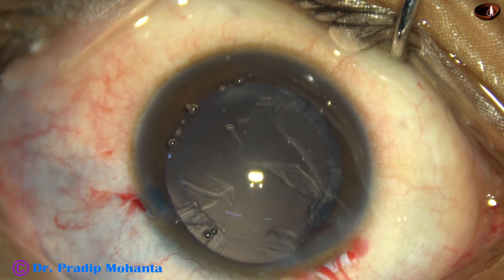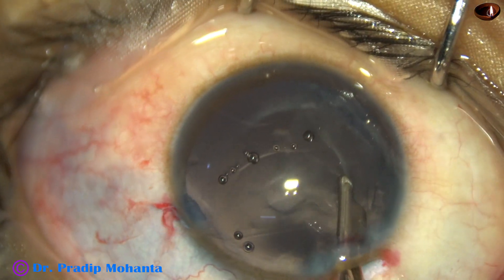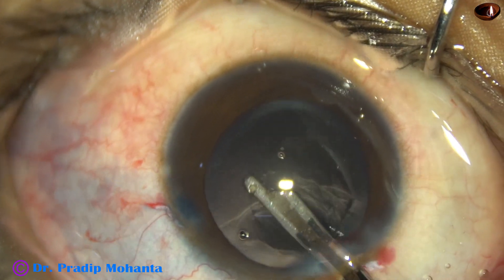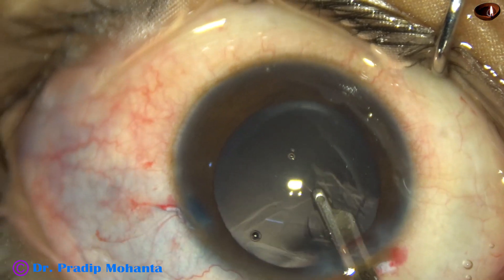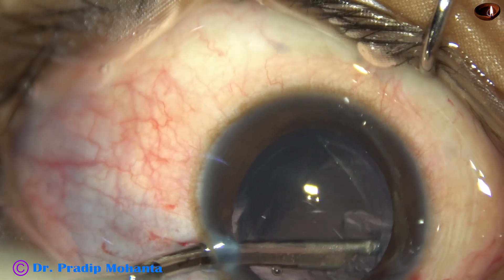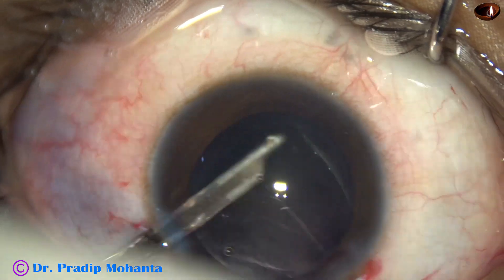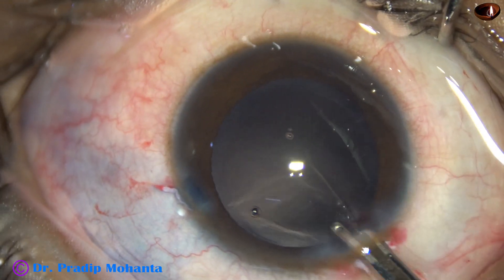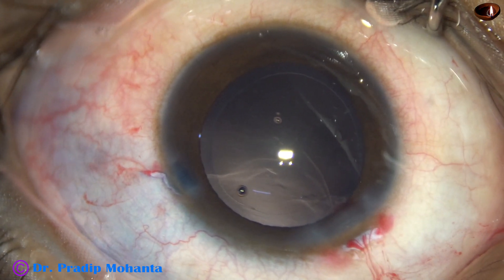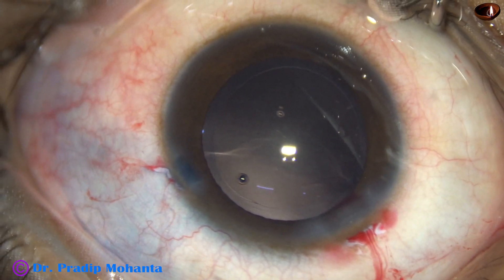Most of the cortex has also come out. The remaining cortex is being removed with a 23-gauge Simcoe cannula. I went through the side port — only one side port has been made, three clock hours away from the main incision. The size of the side port is about 1.7 to 1.8 millimetres.